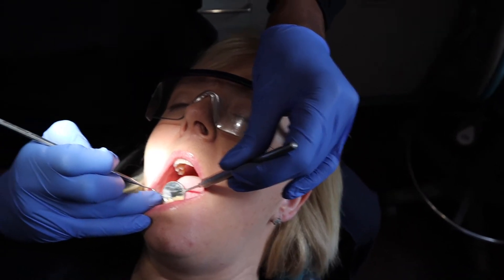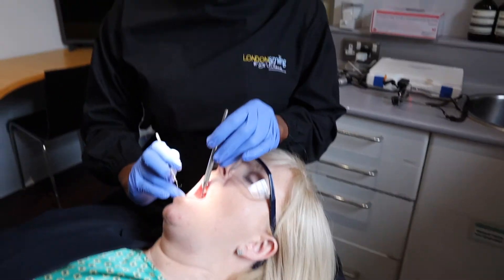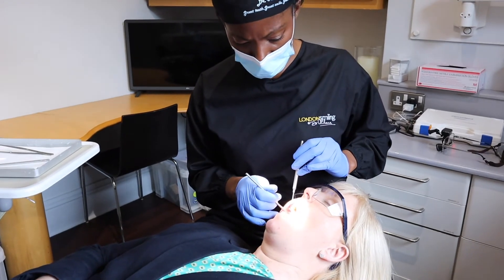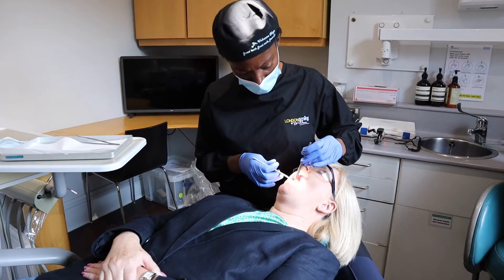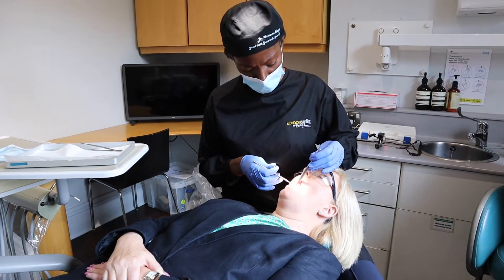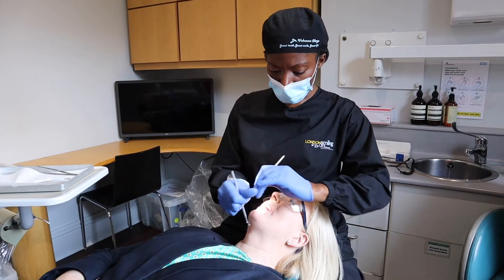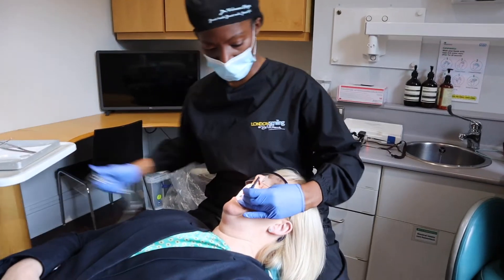Lower right: four is missing, space closed — both fours are missing on both sides. Lower right five, we have a root present. Lower right six is present. Seven and eight are missing. Upper right eight is present. Upper right six and seven are missing, and five is missing as well. Upper left four is missing, space closed. Five is a silver DO. The rest are missing backwards. When we look on the inside, there's lots of calculus.